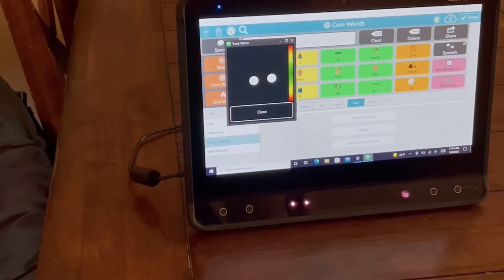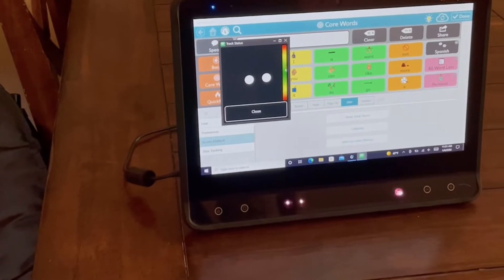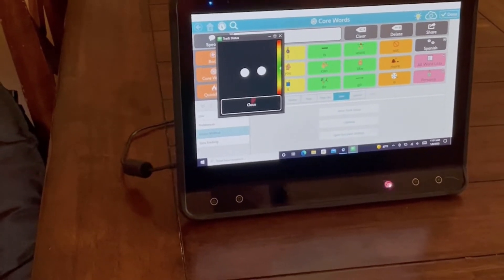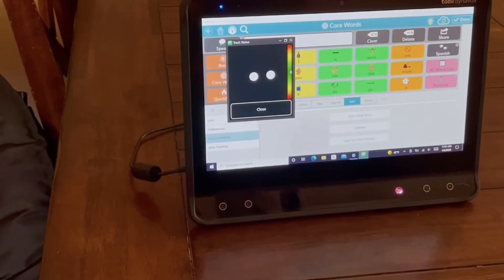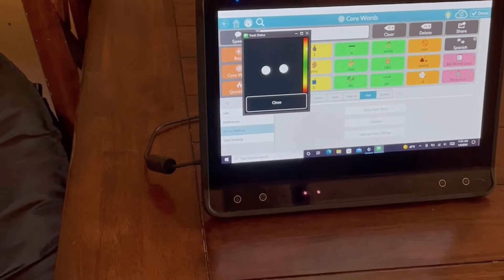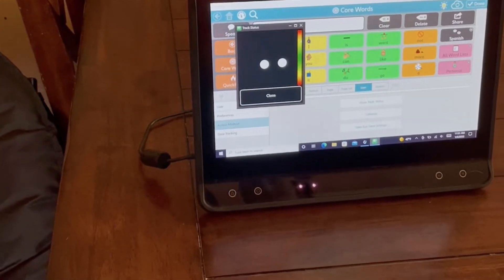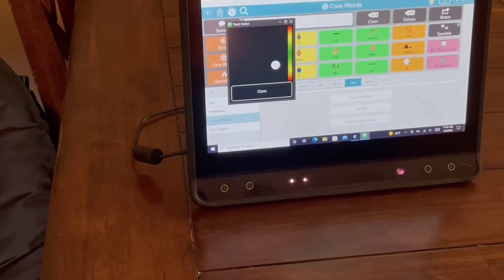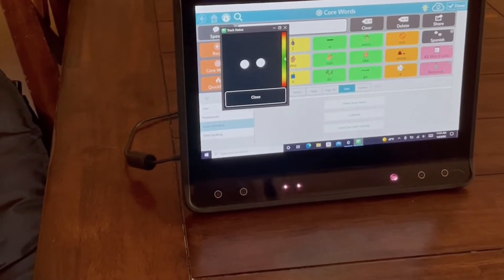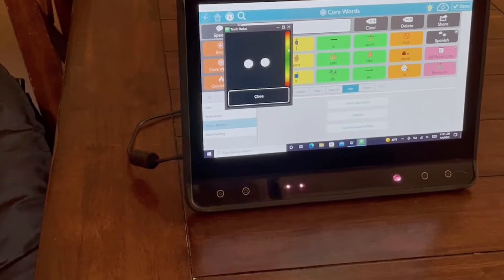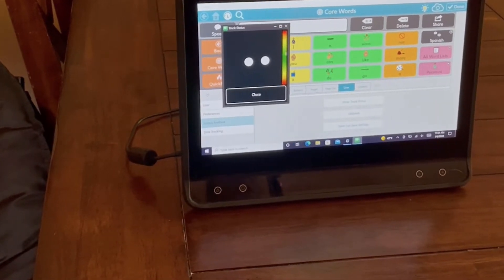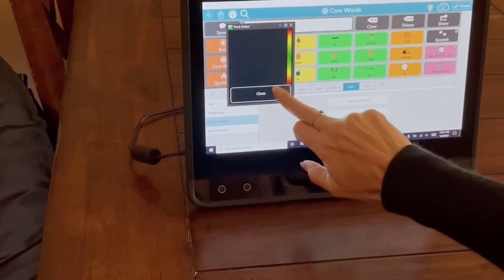You can show your track status — there are my eyes. I want to be far enough away that the arrow is in the green. If I'm too close, the arrow goes up. If I'm too far away, the eyes go away. This is the right distance, and you can see both of my eyes.